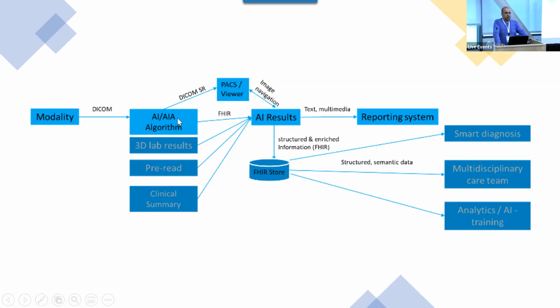Usually, if they follow the standards recommendation, they will represent that as a DICOM SR object, and that can be sent to the PACS for archive and the viewer.